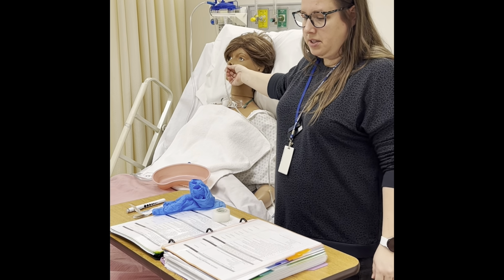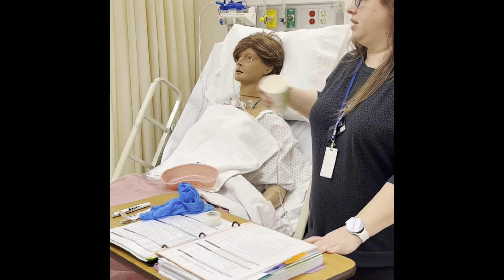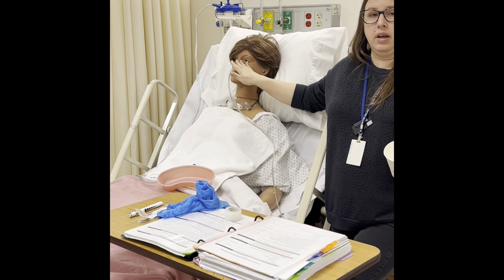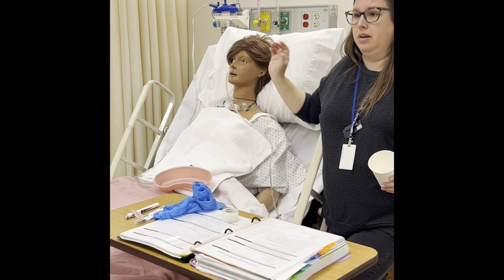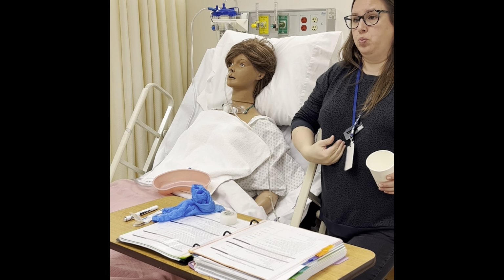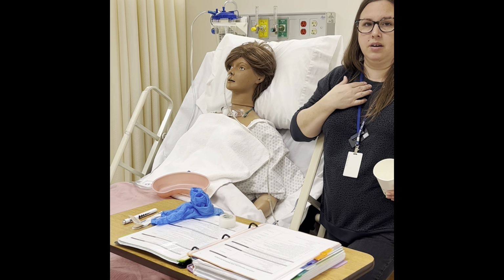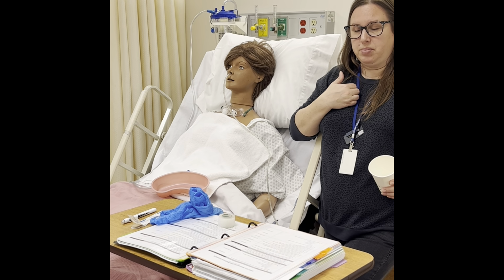From there, it tells you to give your patient a glass of water. The reason why is because they think in the video that it's going to help your patient get the tube down. In real life, again, remember, wet on the inside. If they just swallow, the tube will go down. We dry swallow all the time, probably as you're standing here. You just tell them to pretend to swallow.